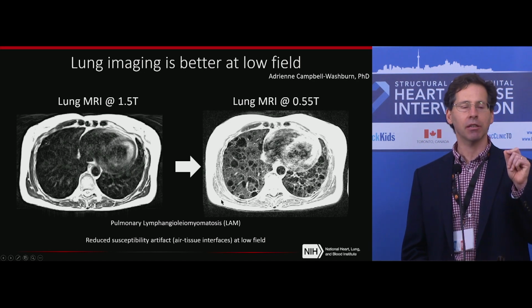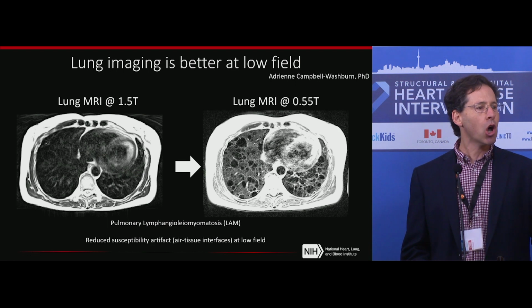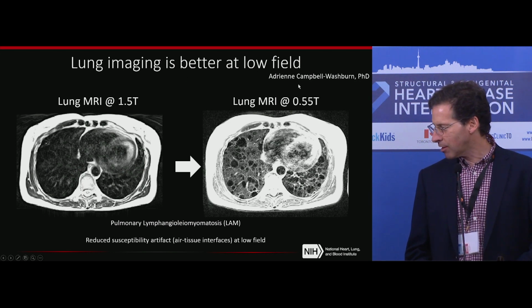You can have a patient take a deep breath. You can have them exercise. You can look at water redistribute with no cost in terms of radiation exposure. Come on, that's promising, right? Dr. Horlick, that's cool, right? So God bless Dr. Campbell-Washburn.